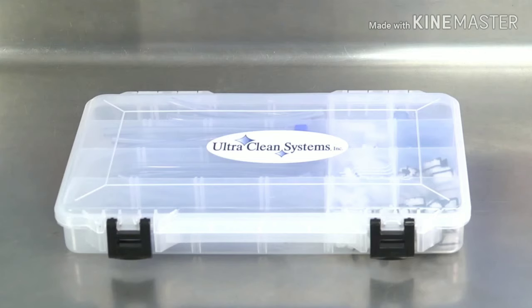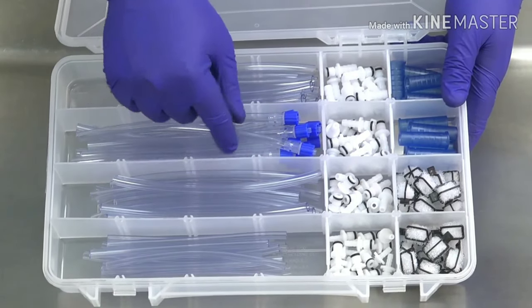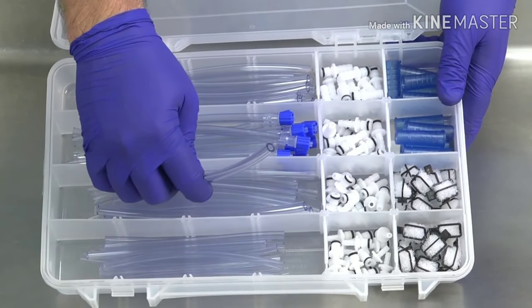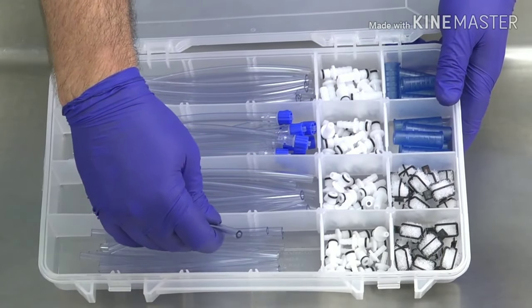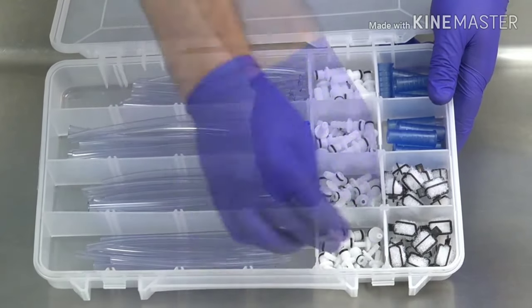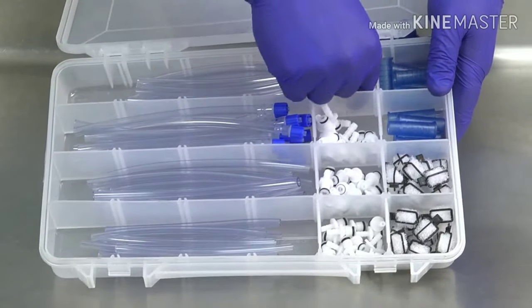One accessory kit comes with each machine. Each kit contains 12 6mm hoses, 12 4mm hoses with lure lock connectors, 12 4mm hoses without connectors, 12 2mm hoses, 12 2mm nozzles, and 24 4mm nozzles, and 12 6mm nozzles.